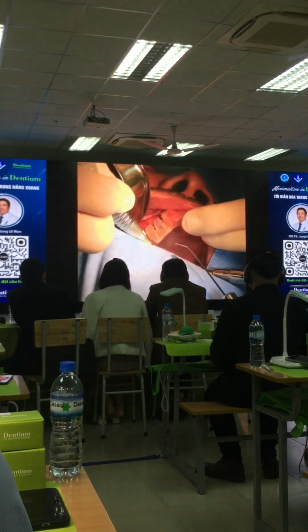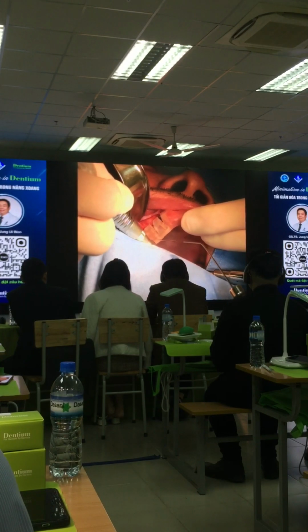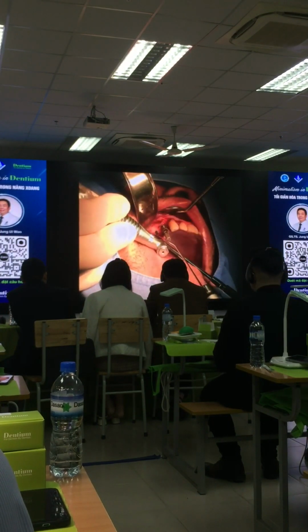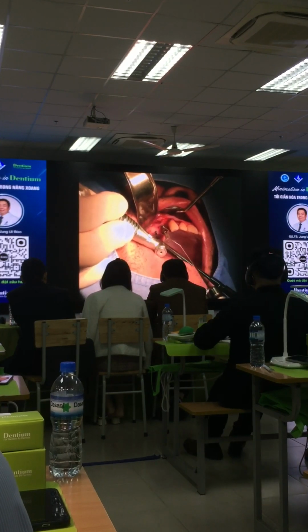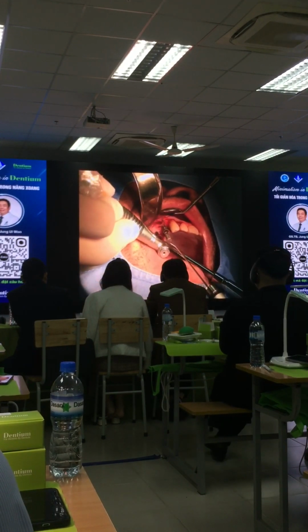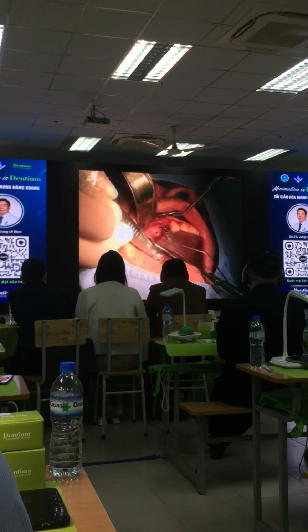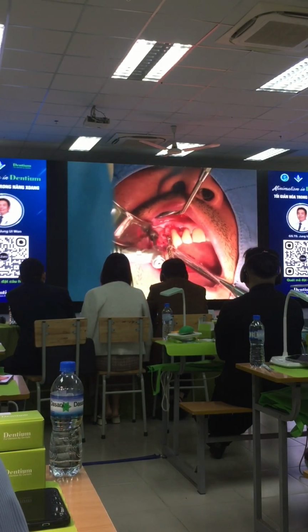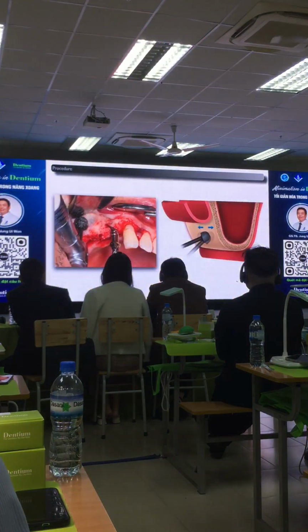There was plenty of bone height in the first premolar area, so I planned this implant first as a reference. And then, using a surgical stent, drilling sites were similarly marked at the location of the other implant.